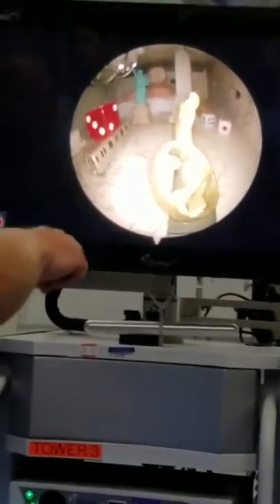Okay. And as you see different things, right? You look at straight ahead, but actually on top. Yeah. Sitting there. Now flip it around the other way. And see that, right? Yeah. So that's helpful to know where you're looking at. Always know that's telling you where your scope angle is pointing towards. Okay? So now I want you to find the taxi cab.